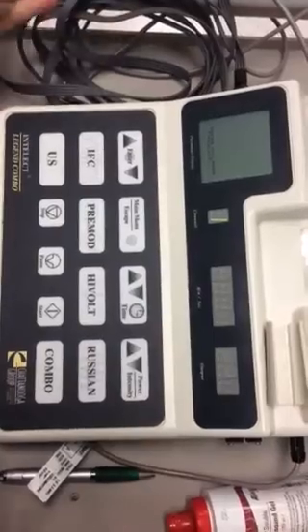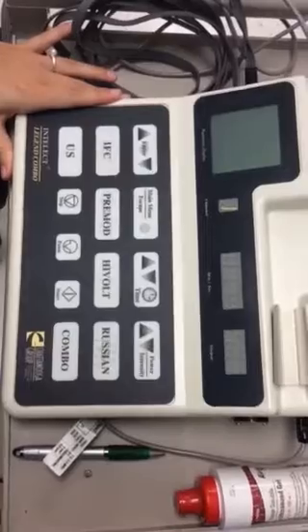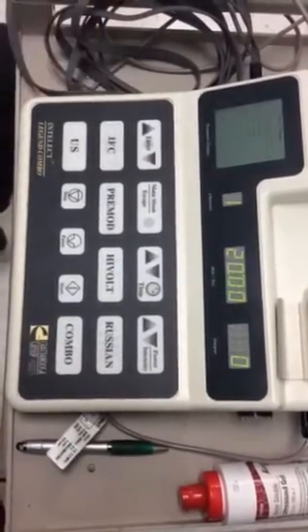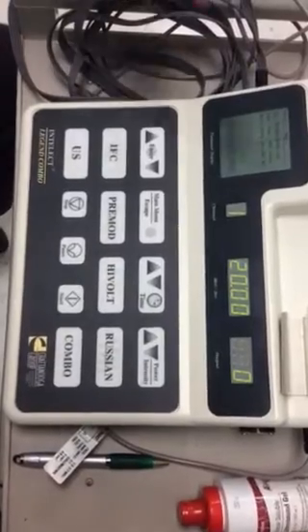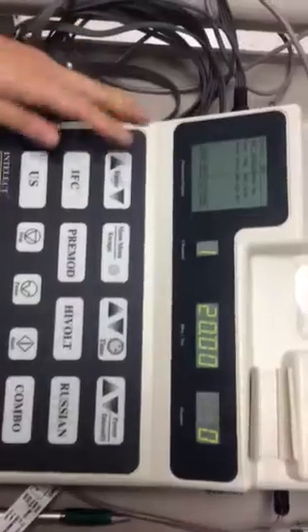So we're going to go through this E-stim machine with all 4 different types of stimulation. First one is the interferential. Both channels need to be selected because of the quadrupolar that we need.